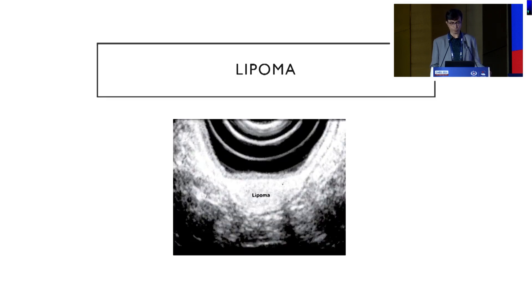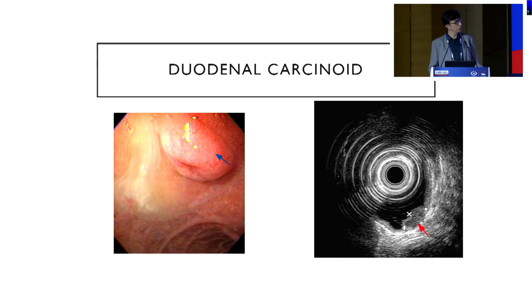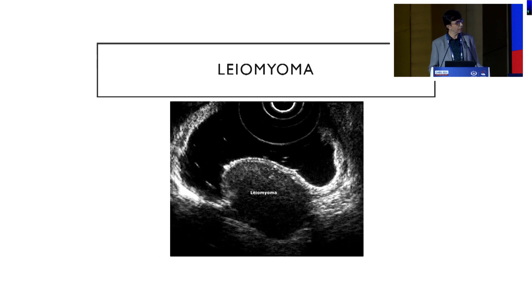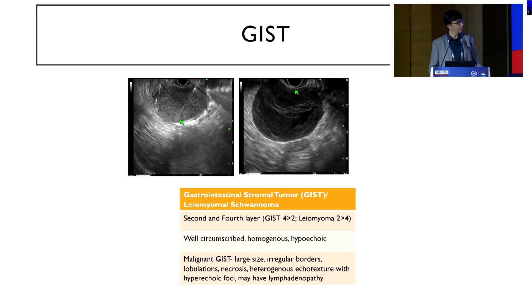Here are some examples: this is a lipoma arising from the third layer. You can see a duplication cyst — you can be sure of a duplication cyst because it is anechoic with posterior acoustic enhancement. This is a duodenal carcinoid arising from the second layer. This is a leiomyoma arising from the fourth layer. Granular cell tumor of the esophagus. And GIST, which is perhaps the most important SEL to diagnose fully to ascertain whether it is a pre-malignant condition.